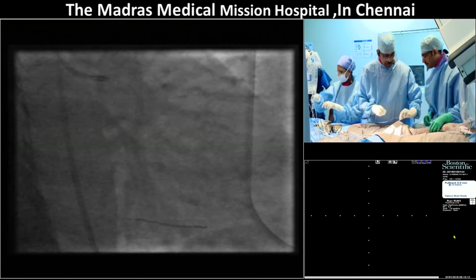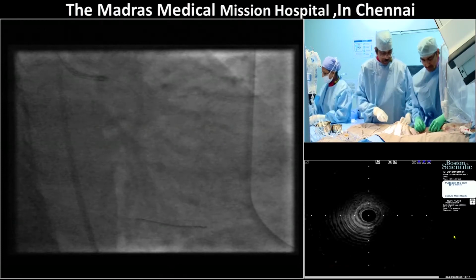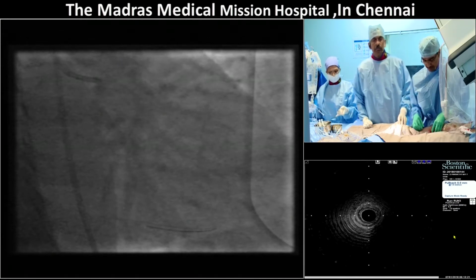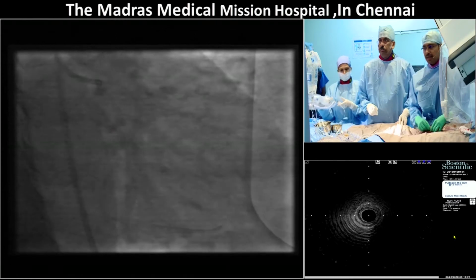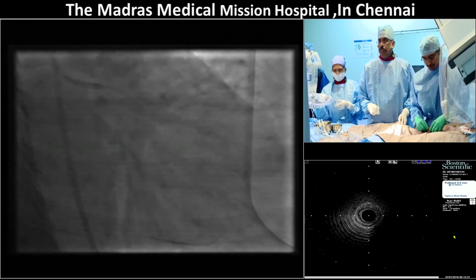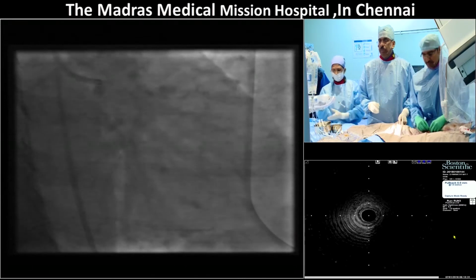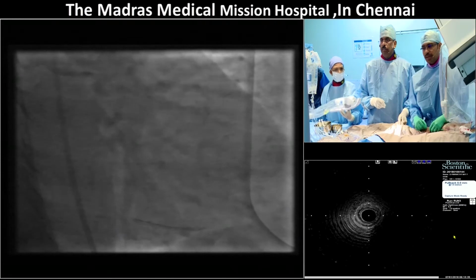So is there any difference of opinion here on that strategy on the proximal segment? I think that is okay. You took a 3 mm non-compliant balloon. You don't have to do anything. Yeah, non-compliant. You can even use a compliant balloon, but we're just going at nominal. It just went at 10 atmospheres. It was just to open up the malapposition, not really to affect the plaque. And still we have some malapposition. We are not worried much.